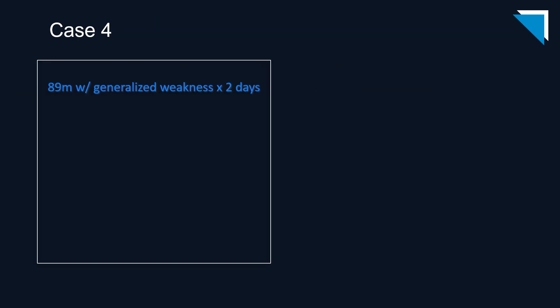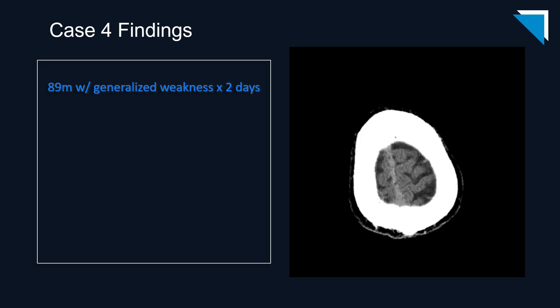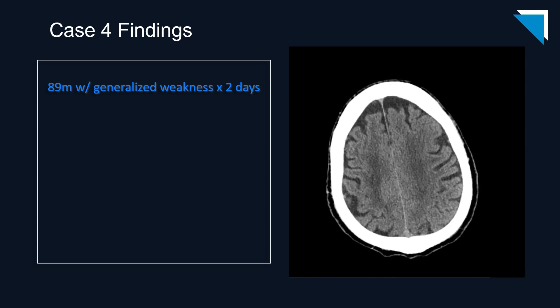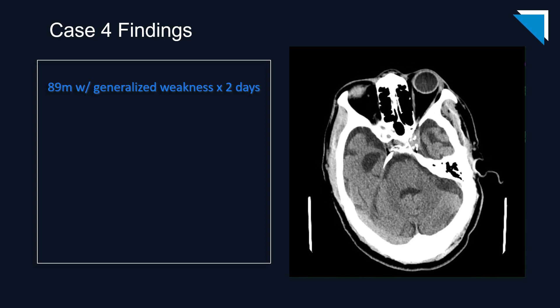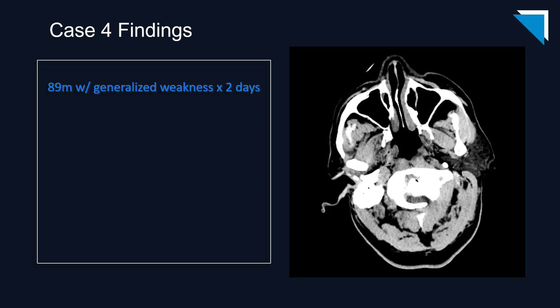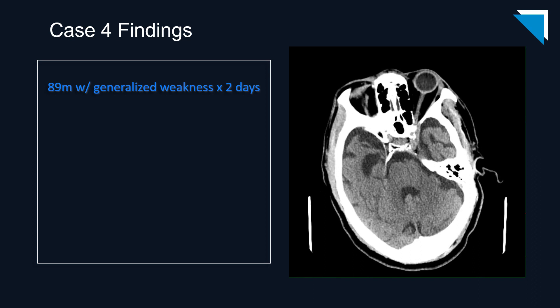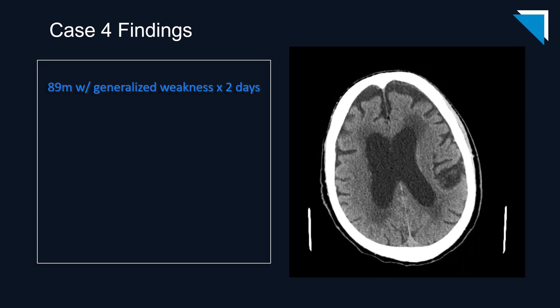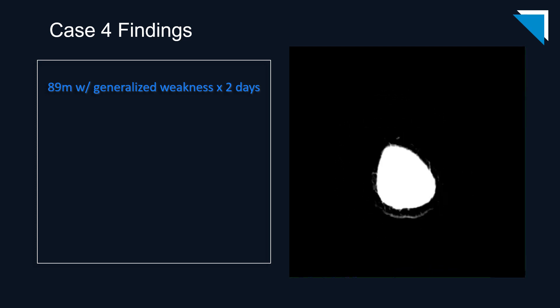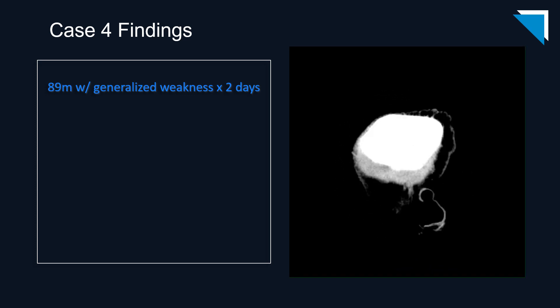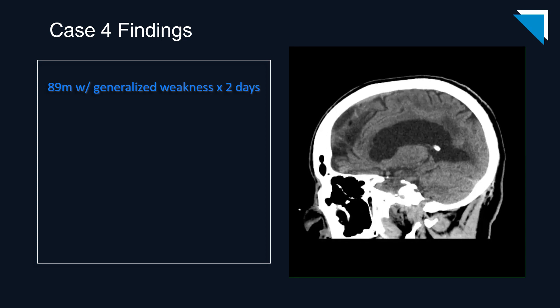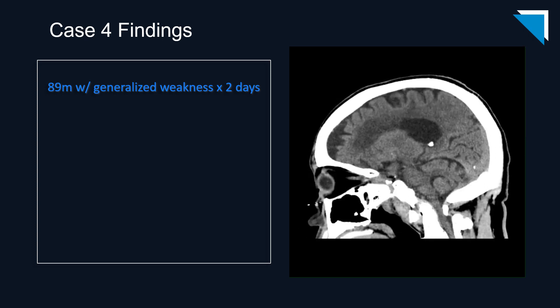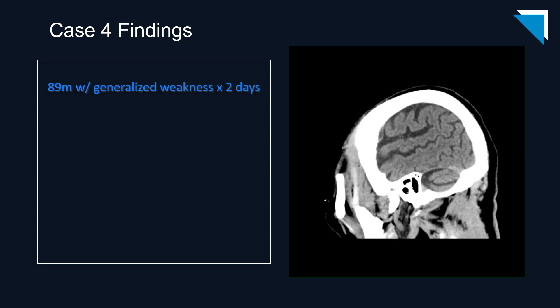Next up is an 89-year-old man with generalized weakness for two days. These are the axial images from a non-contrast CT scan of the head, and the sagittal images from the same patient. Always remember to request the coronal and sagittal reformatted images if you don't have them — there is important pathology that can easily be missed on the axial images.